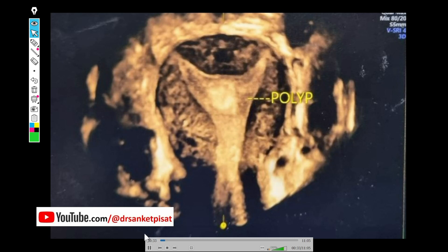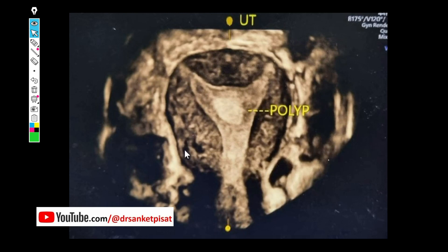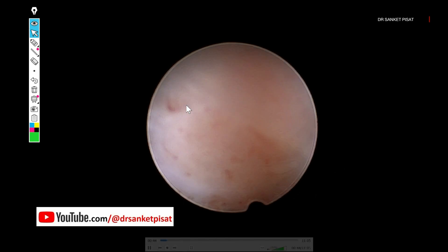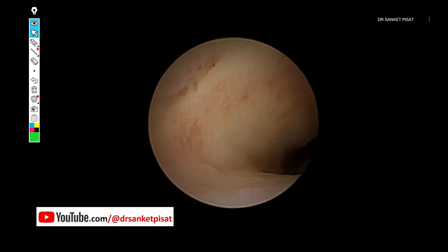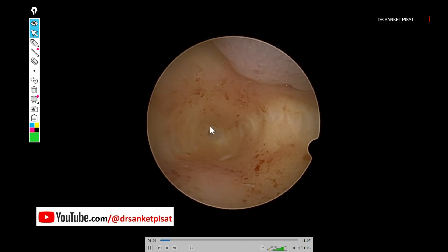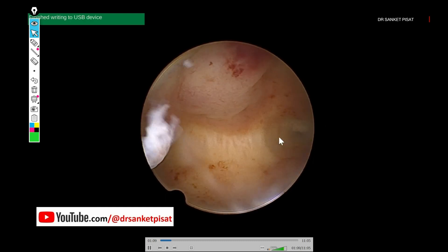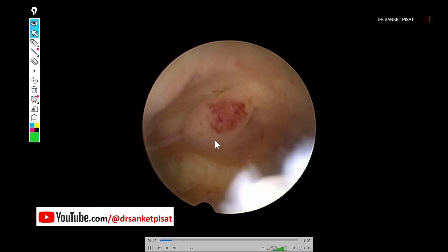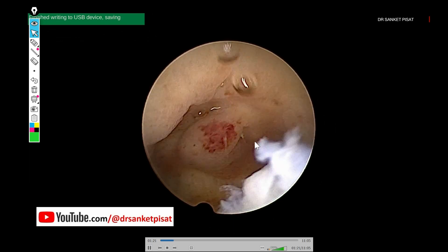We talked to the patient and convinced her about the need for a septal incision along with a polypectomy. In another differently shaded film, you can clearly see the cornua at both levels and the polyp right in the center. As the telescope goes inside, you can see the ostium on the left of the screen, and one cannot miss the projection right in the center — with the polyp on top. This mound coming between the two ostia is clearly the septum, and to someone who has done sufficient hysteroscopies, there is no doubt that there is a septum here along with a polyp.